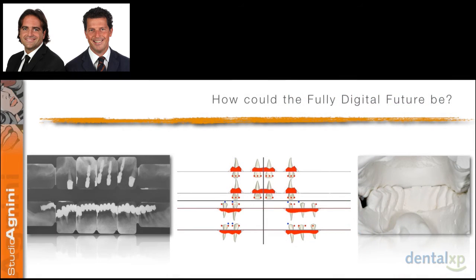Beside the photographic setup, it's important also to collect this kind of information: full mouth x-rays, periodontal evaluation before and after the professional hygiene, and also the study model evaluation. From these three things we can collect even more information.